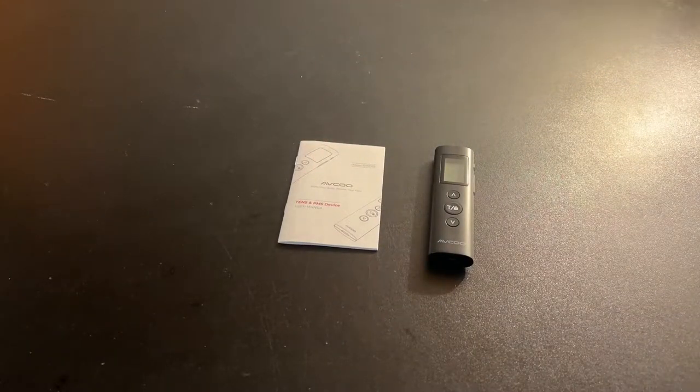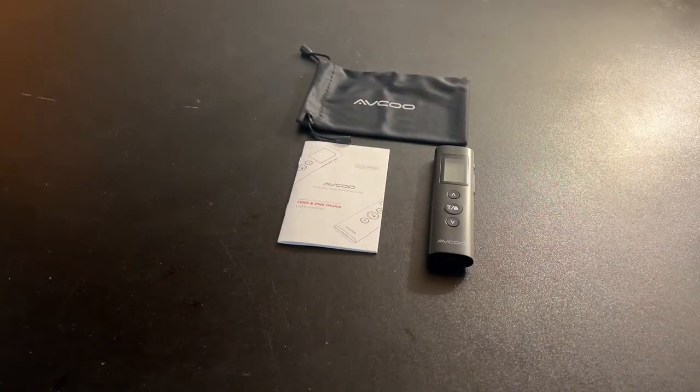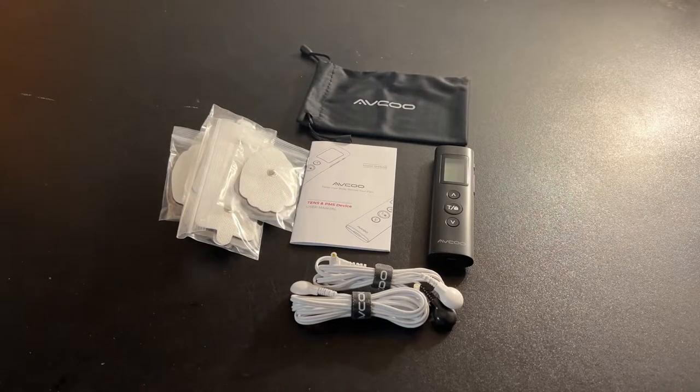You've got your manual, a branded bag, cables for connecting the pads to the TENS device, your charging cable, and pads for large, medium, and small — and of course your silica packet. Don't eat this. That's the unboxing for this much smaller TENS unit device. I'll have a full review on the channel here shortly. Bye.